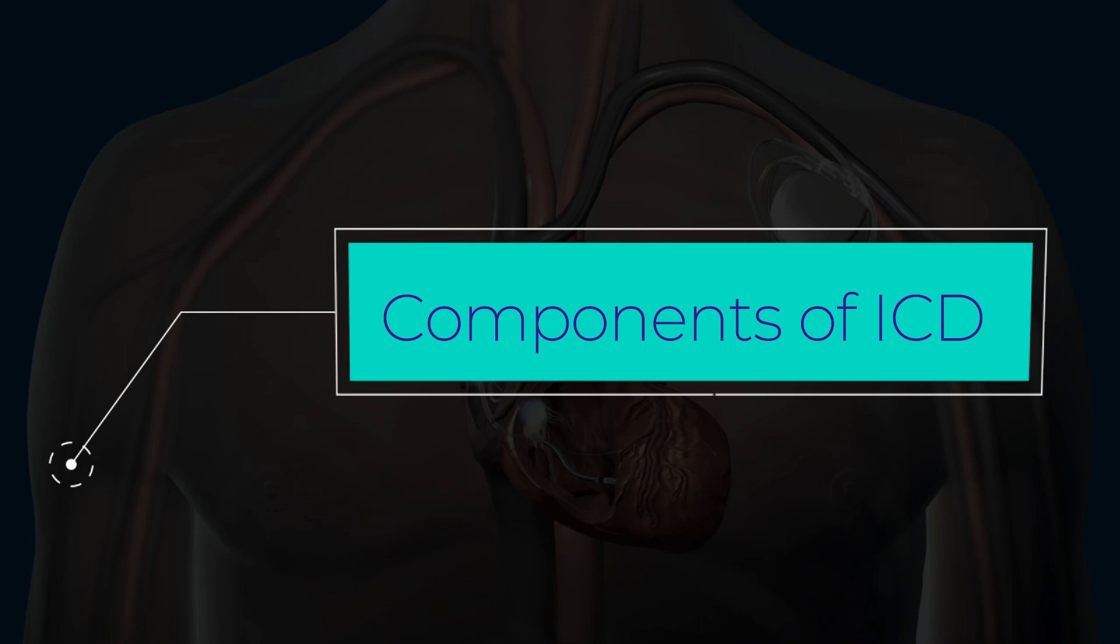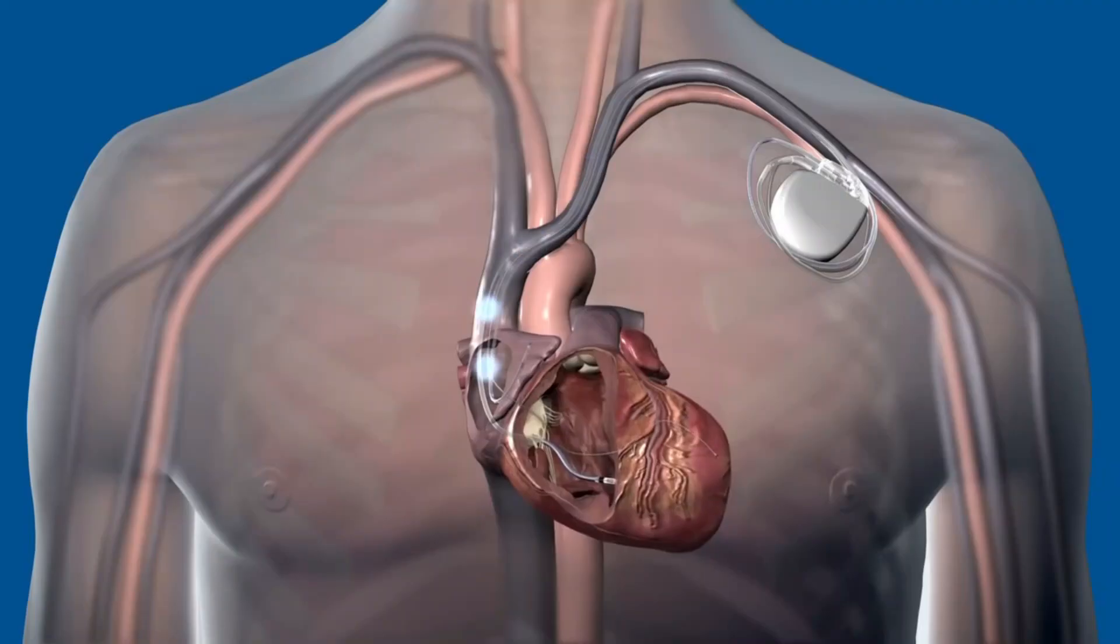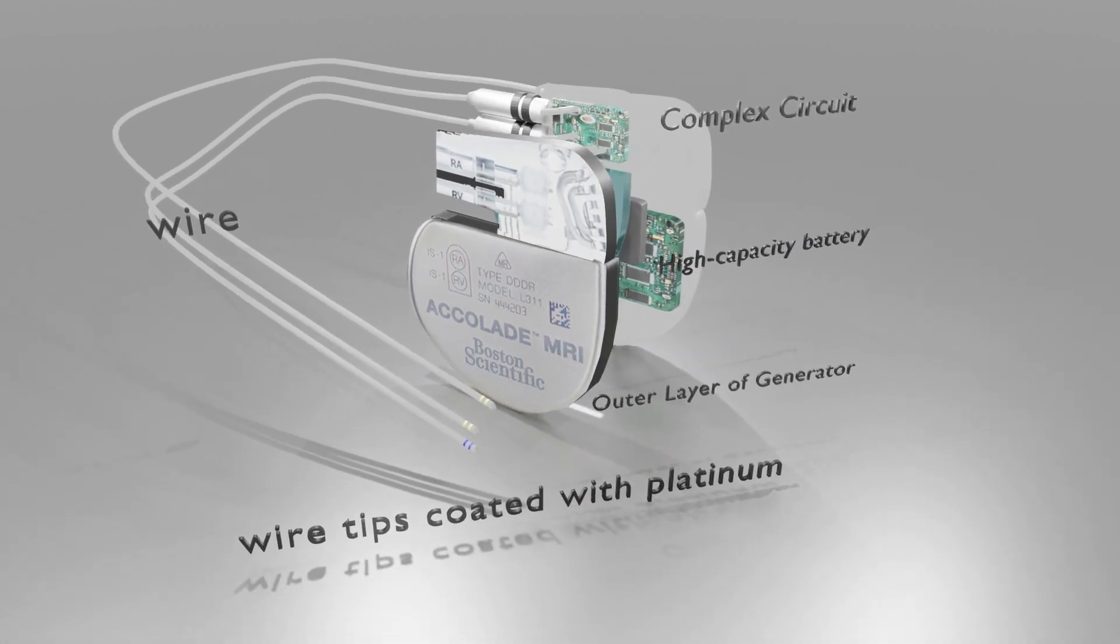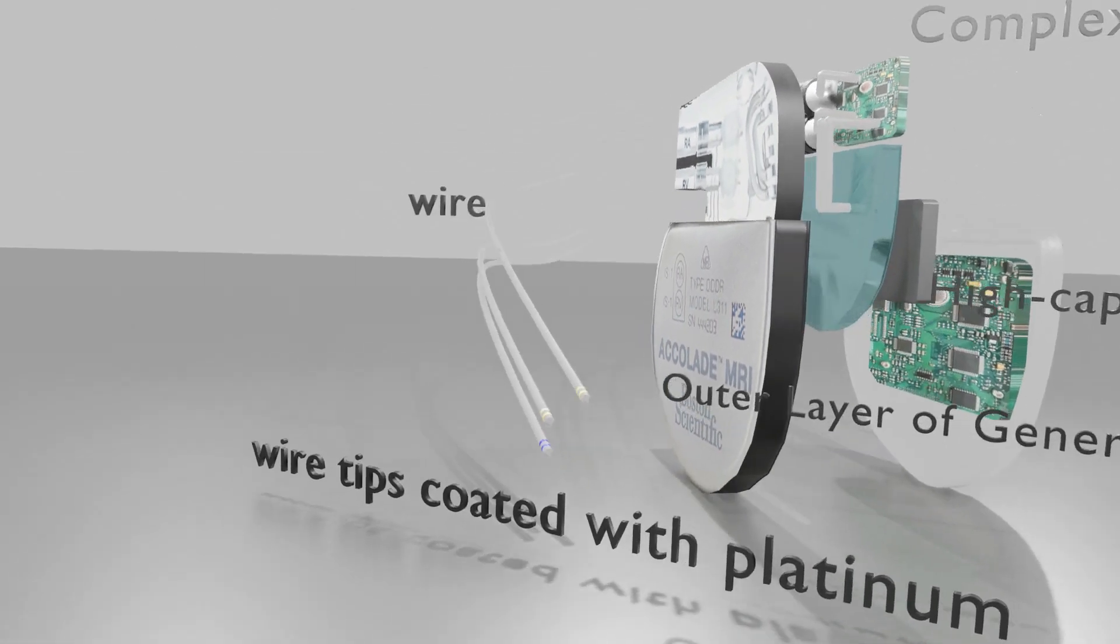Let's look into the components of an ICD. The ICD mainly consists of an outer layer of the generator, complex circuitry, a high-capacity battery, the wires with electrodes, and the capacitor. The first component is the outer layer of the generator. It is made of titanium and other metals, with complex circuitry and a high-capacity battery inside. The wires have inner conductors with outer silicone and polyurethane insulation. The tips of the leads are usually coated with platinum or another similar metal.